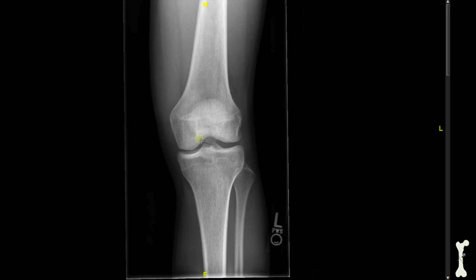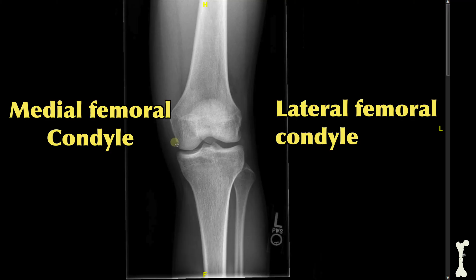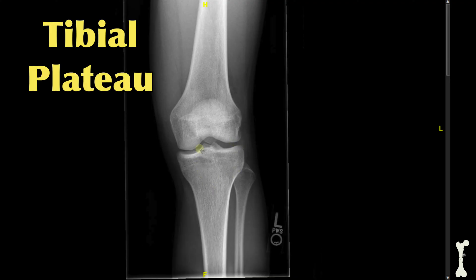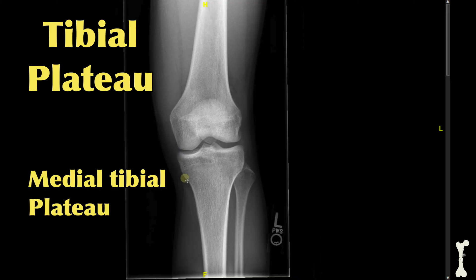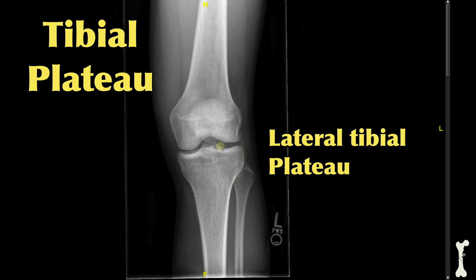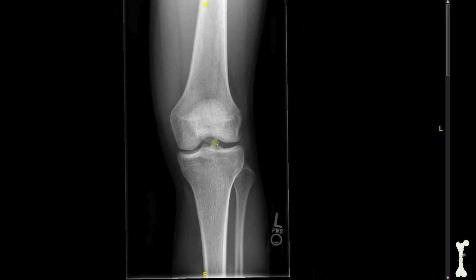If you look down at these areas of the thigh bone, these are called the condyles. If this is the outer side of the knee, we refer to that as lateral. If this is the inner side of the knee, we refer to that as medial. So we call this the medial femoral condyle, and we call this the lateral femoral condyle. The part of the shin bone that flares out we call the tibial plateau — the area on the inner side is the medial tibial plateau, and the area on the outer side is the lateral tibial plateau. These two little bumps are the tibial eminences. And this broader area of the fibula we call the fibular head.